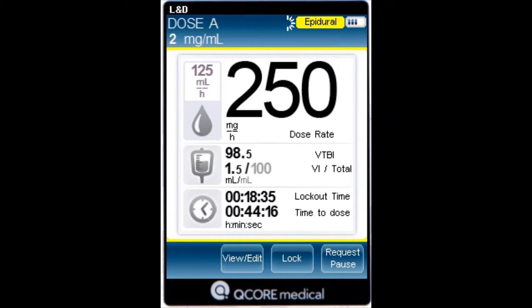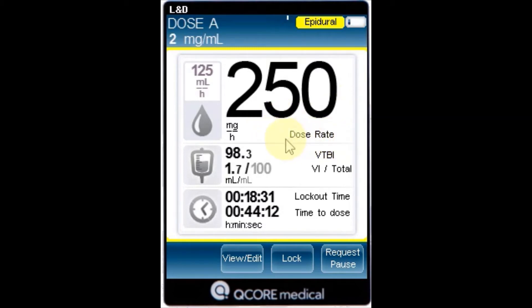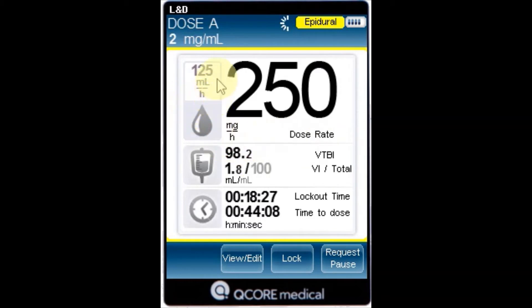Rate — the current infusion rate for all dose units other than mLs per hour. The calculated rate will be displayed in mLs per hour both in the View System menu and in the running screen.